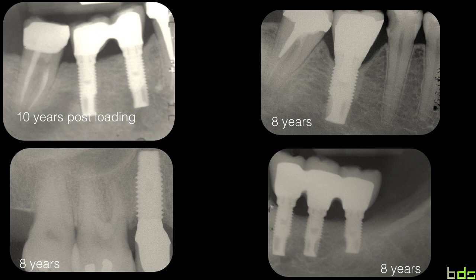So all the implants that were placed should have lost the bone till the first thread, and then eventually lose bone. Well, all these implants, they're standing still. The bone is still very stable. So there must be another factor.